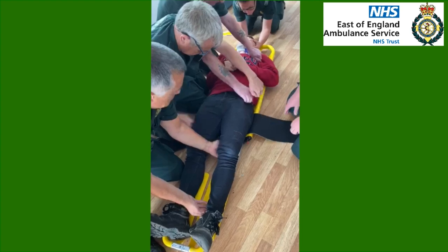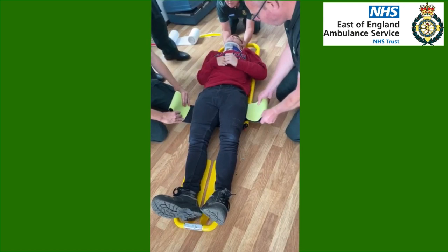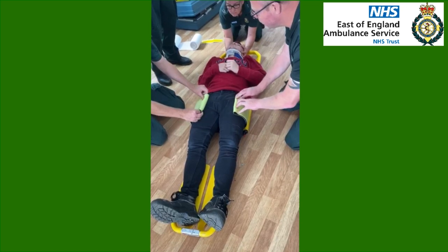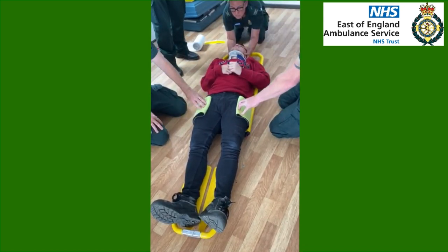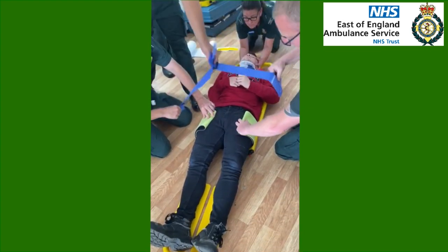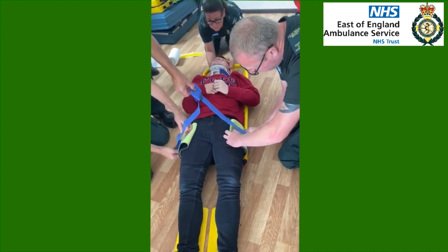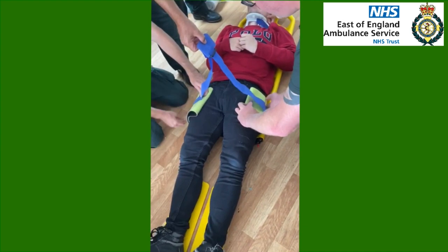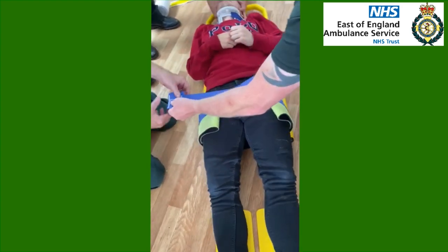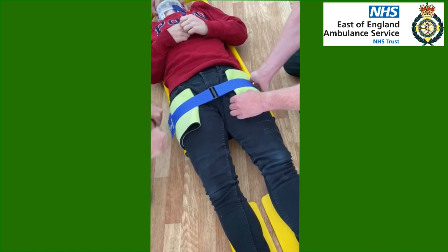Okay, you stay on C-spine. If everybody else can move away, myself and John will get the pelvic binder in position. You can cut these or you can just fold it over like that. We're going to bring it over to there, ideally making sure there's nothing in the pockets, and obviously we're going to put the skin to the scoop in a real life situation. We take these velcros and get them as low as we can underneath here, then take on the velcro and bring it together, going down as far as we possibly can to secure the pelvis.